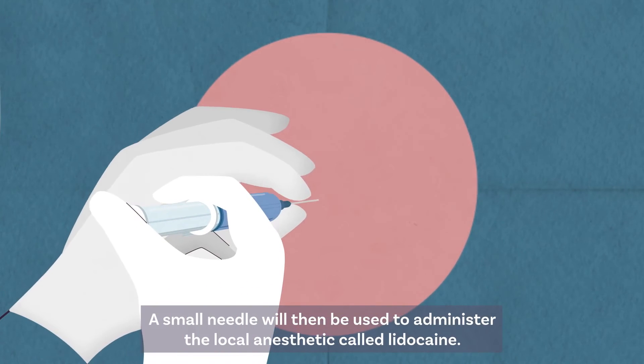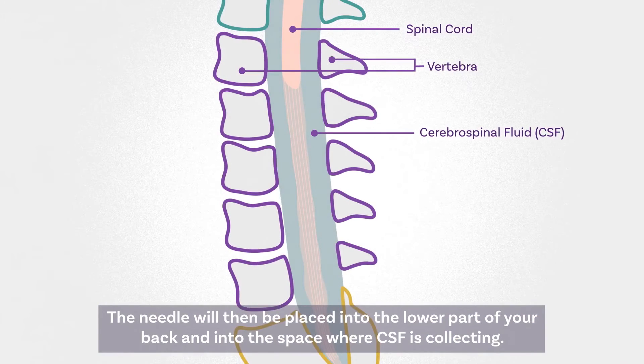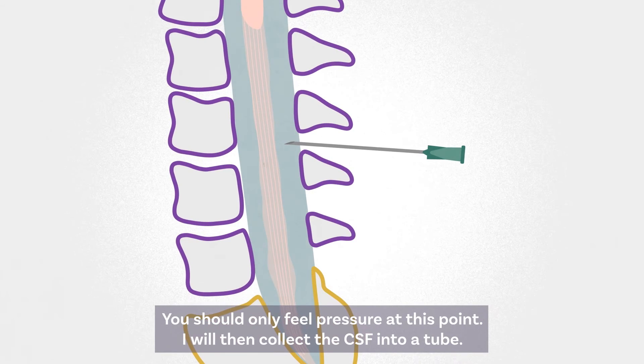A small needle will then be used to administer the local anesthetic called lidocaine. The needle will then be placed into the lower part of your back and into the space where CSF is collecting. You should only feel pressure at this point.